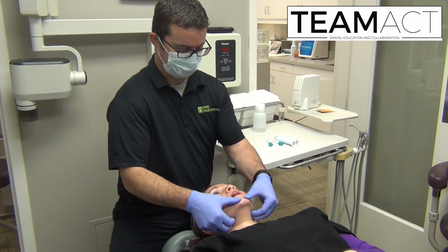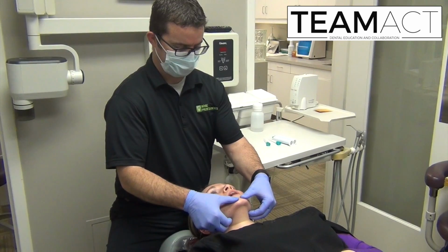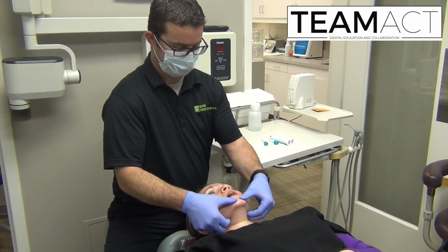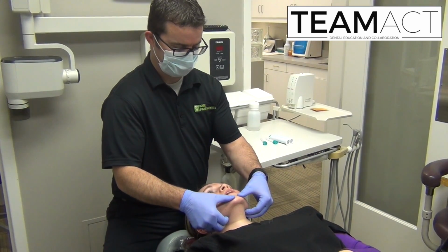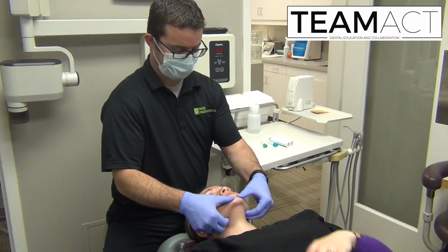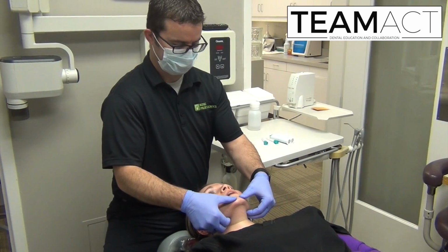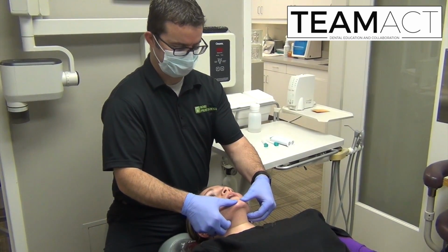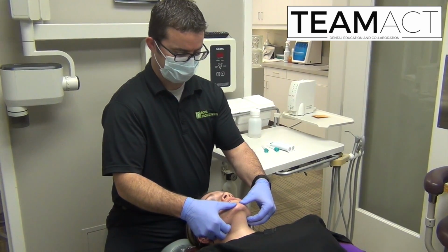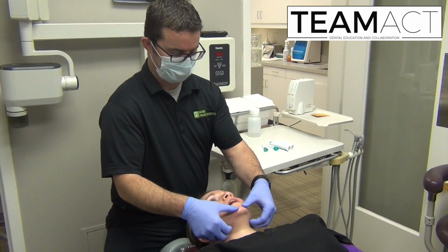I'll then try to deprogram her jaw by lightly trying to direct the opening and closing of her jaw. Once you can feel that she has relaxed enough, with that light support, I'll instruct her to close and stop when she first feels her tooth contact. We'll identify that location, repeat it several times to identify where and if it is repeatable. As you can see, she identifies the same location twice.